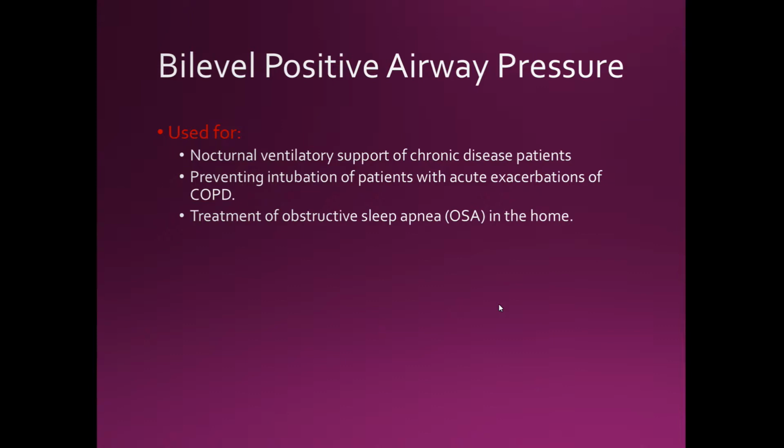Now, let me say this. BiPAP falls under ventilation. CPAP falls under oxygenation. If you have a ventilation issue based on your blood gas, you will use BiPAP because that is a form of ventilation.